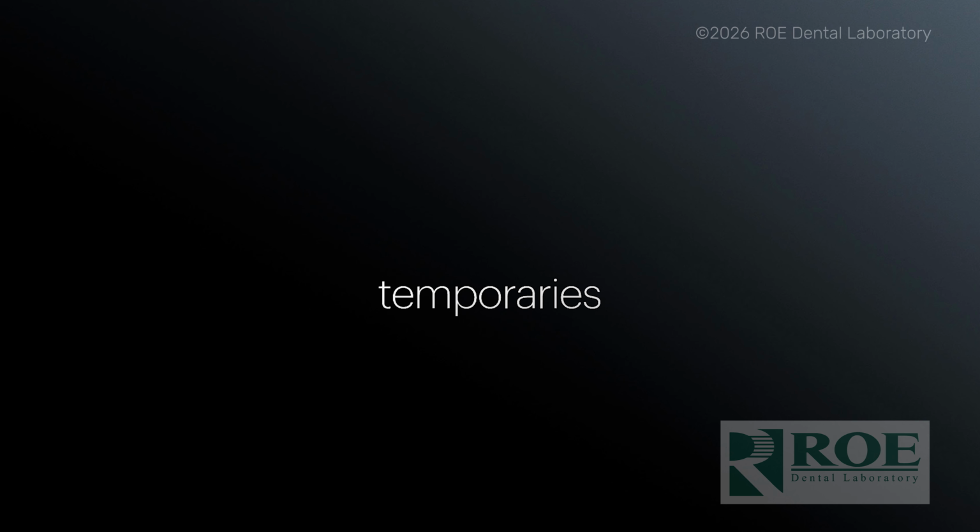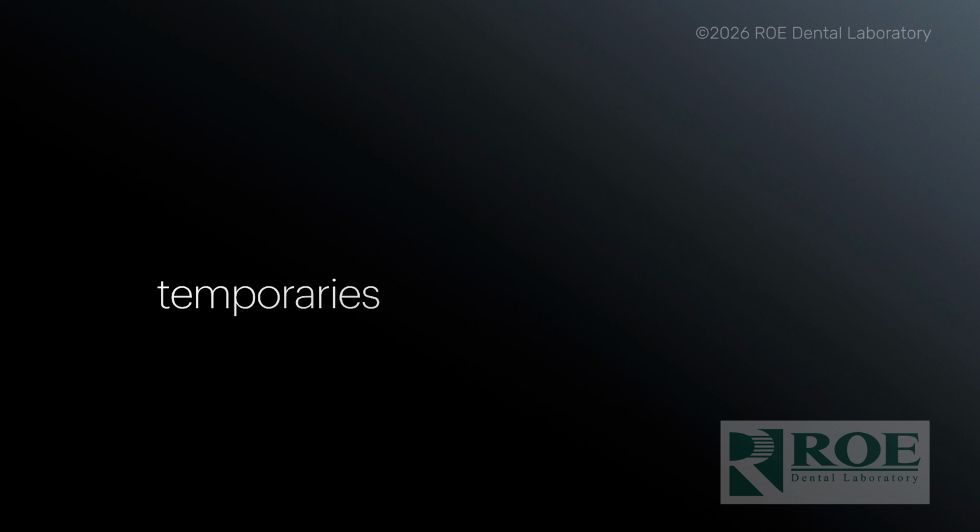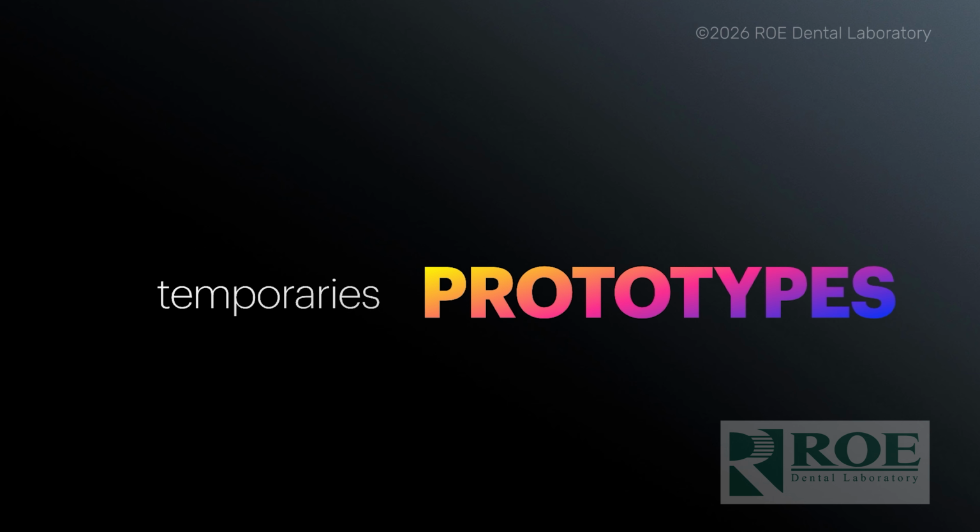And so what needs to change in our mindset is the concept of temporaries and shifting that to prototypes. And the difference is a prototype is a true exact replica of the desired outcome. So it is the exact copy of what we're trying to do. And that's a big fundamental shift from temporaries, because it allows us to do things that we couldn't do before. All of a sudden, now we can test the contacts if we wanted to.